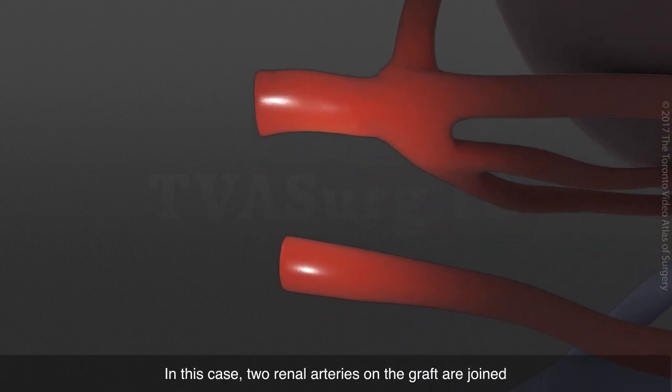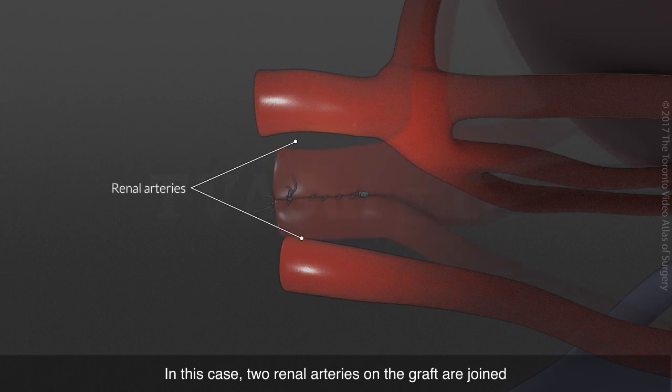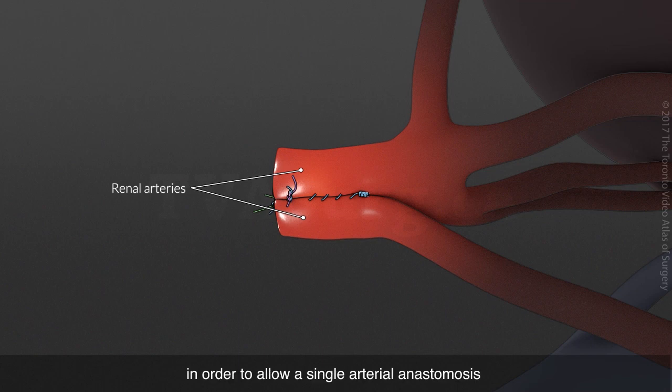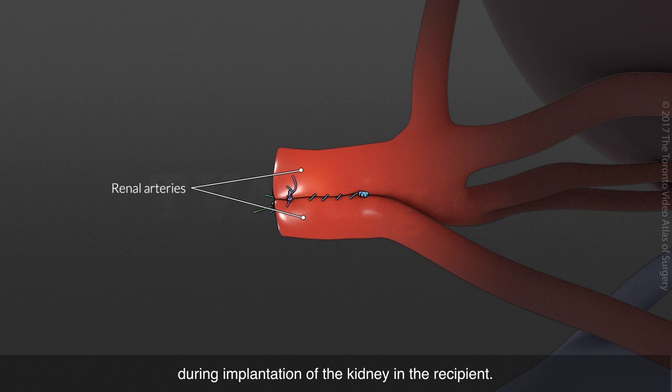In this case, two renal arteries on the graft are joined via a side-to-side arterioplasty technique, in order to allow a single arterial anastomosis during implantation of the kidney in the recipient.